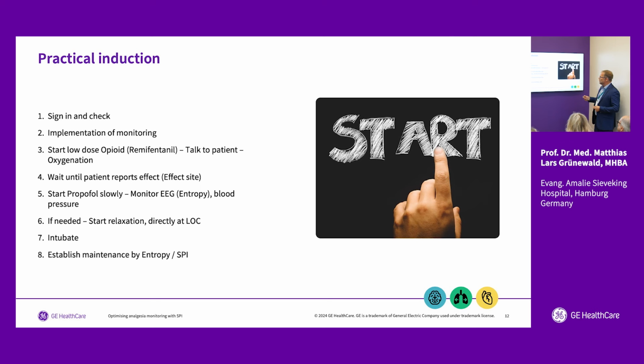And here, just an advice: if you do TIVA anesthesia using remifentanil and propofol, I always start the remifentanil slowly before I start the propofol, let it come to the patient, see the effects and side effects, and then slowly induce propofol using the entropy.